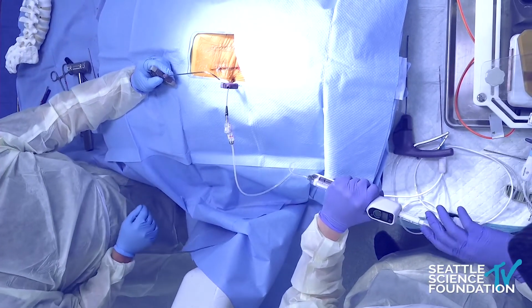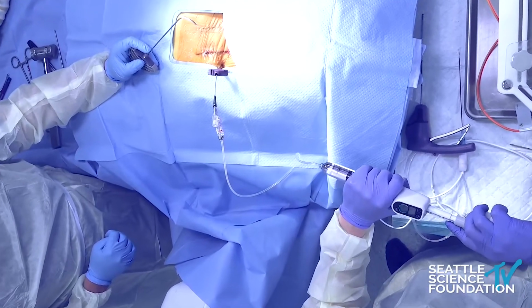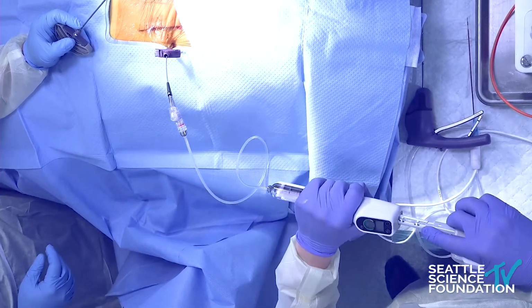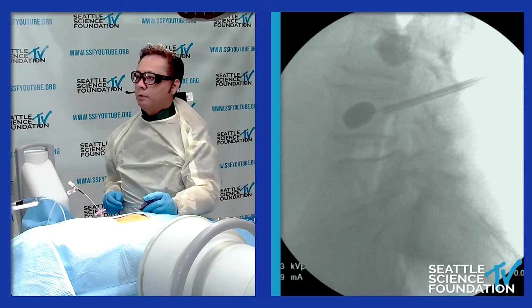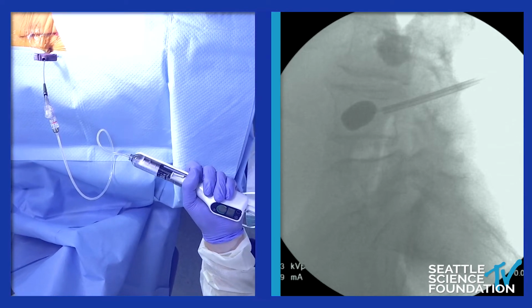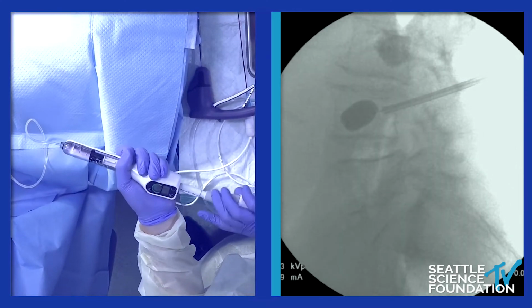If you want to look at the lateral view of the fluoroscopy, Dr. Freyer, it's inflating. Where are we at now, PSI? About 350, with about 1.5 cc's of contrast in so far. Yep. Max capacity that balloon holds is 4 cc's. Let's take a shot. Excellent. A little more. We're staying away from the end plates.